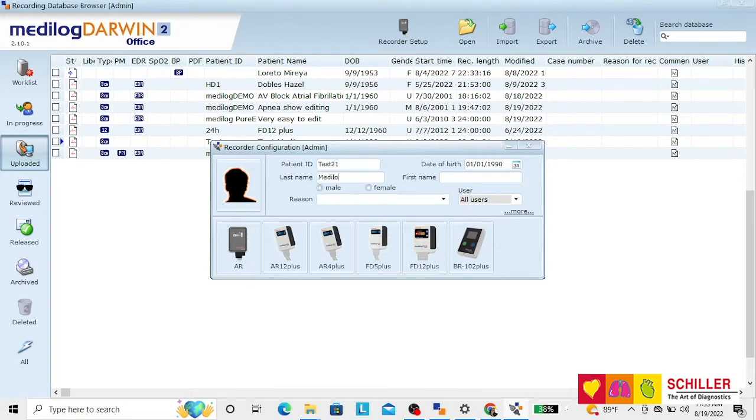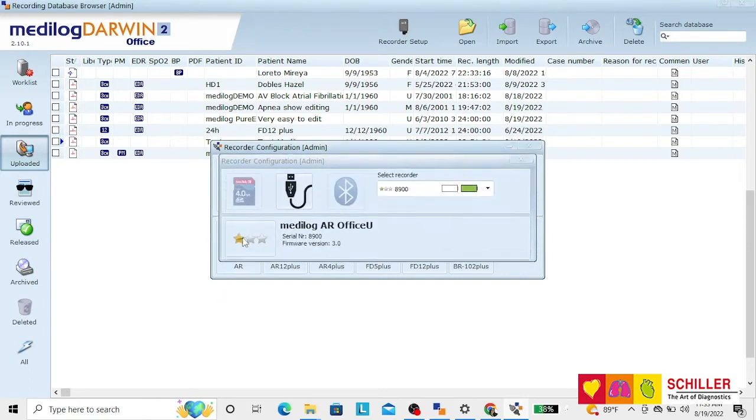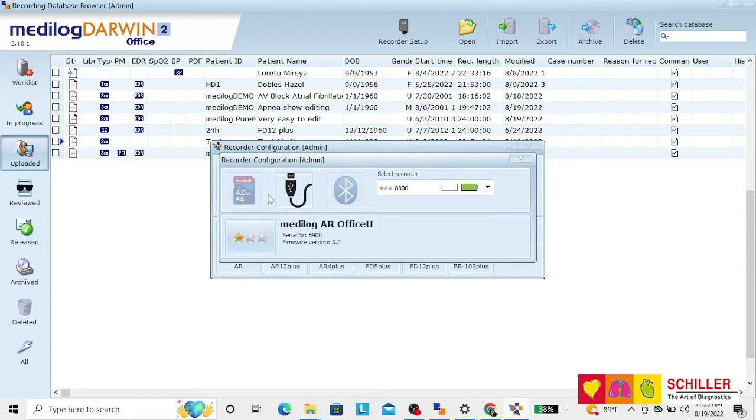and select the recorder AR. On screen you will have that the recorder is connected through the USB cable.